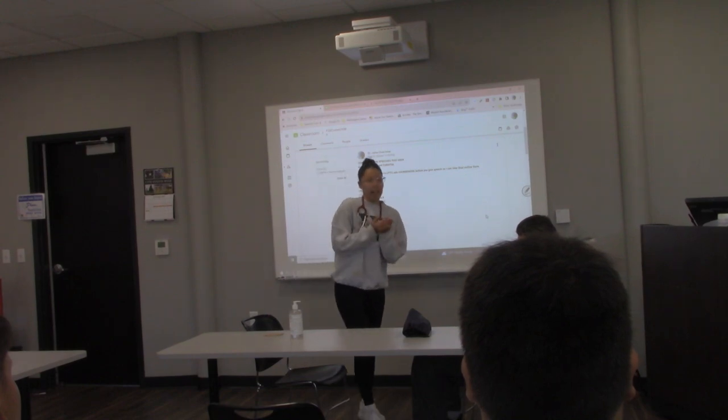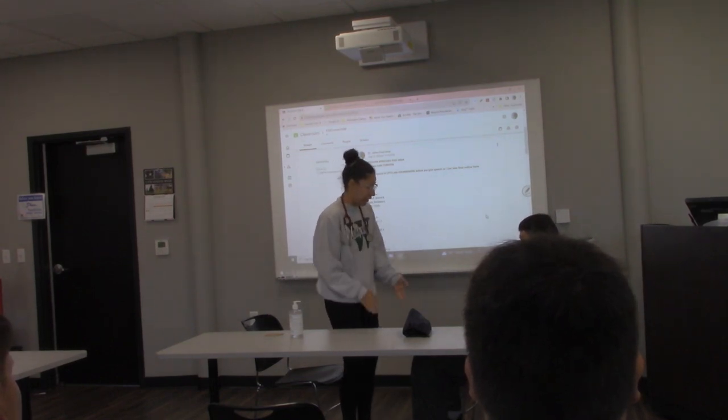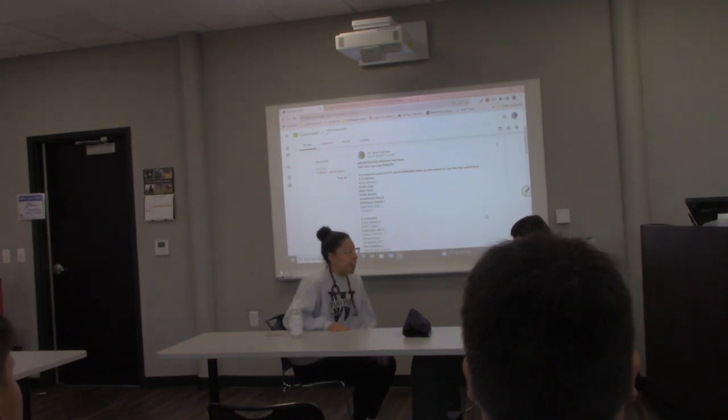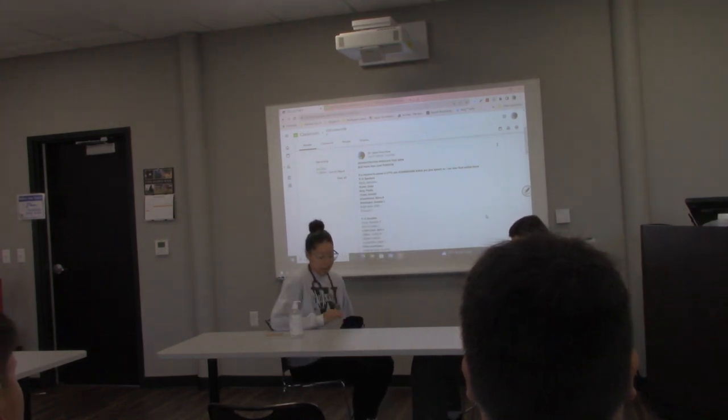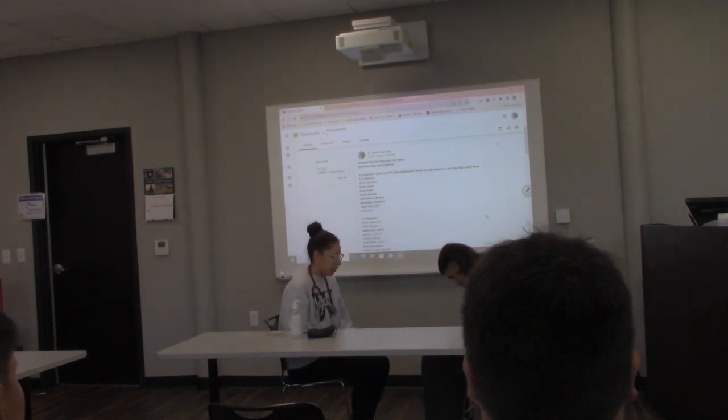What I like to do first is inform the patient. So: hi, my name is Sierra, and today I'm going to take your blood pressure. You want to make sure that your patient's feet are flat on the floor and their legs are not crossed.